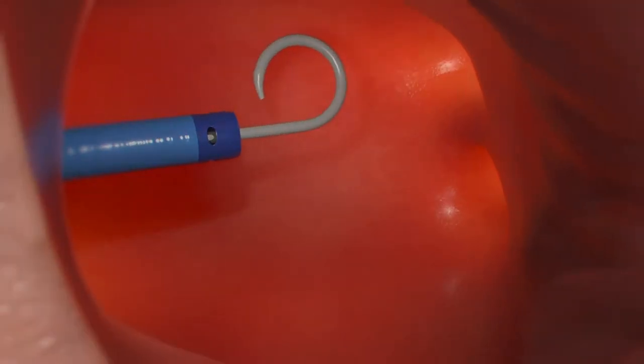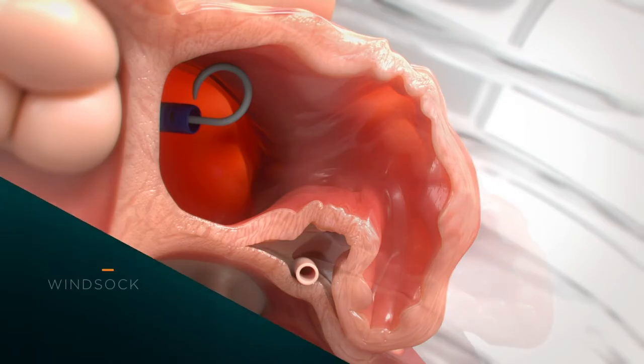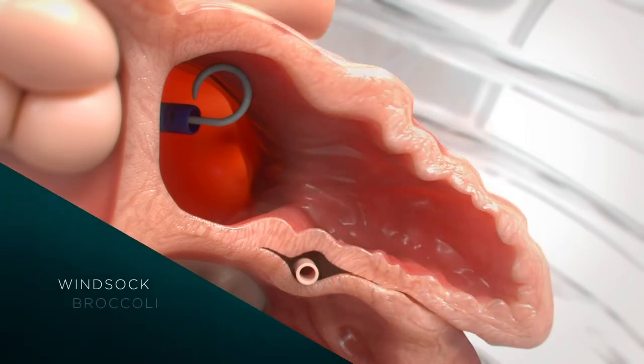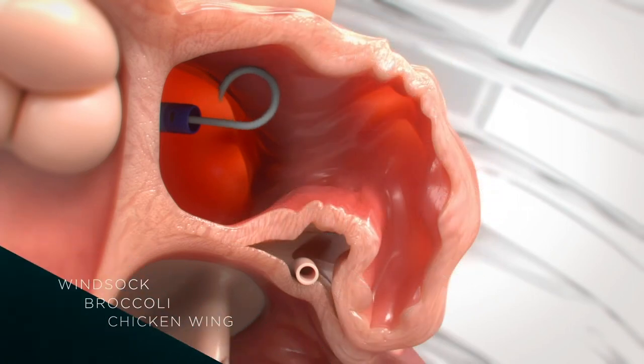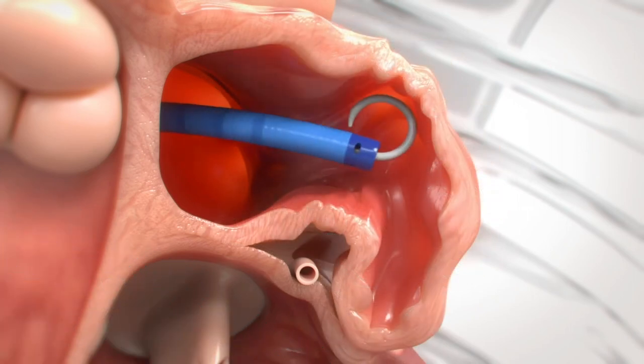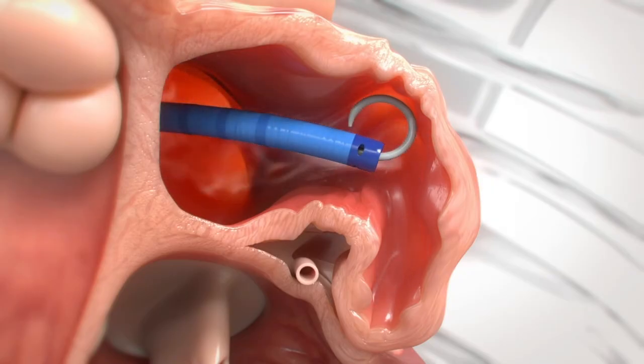Watchman Flex is designed for precise placement in the left atrial appendage, from windsock to broccoli to chicken wing. Measurements are taken of the appendage with TEE. Contrast may be injected at any time to help visualize the left atrial appendage. At this point, the appropriate size Watchman Flex is selected.